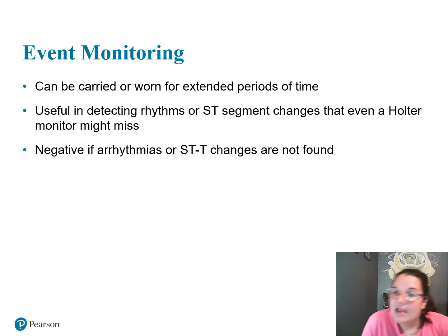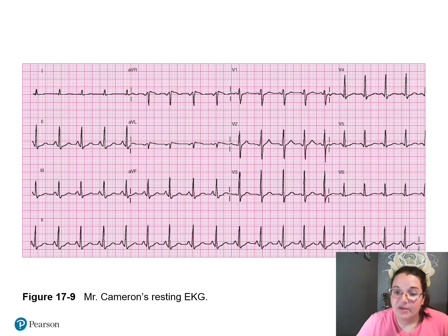So it can be carried or worn, just like our Holter monitor, and is useful in detecting rhythms or ST segment changes that even a Holter monitor might miss. And it is negative if the arrhythmia or ST changes are not found. So you could have a positive or negative event monitoring.